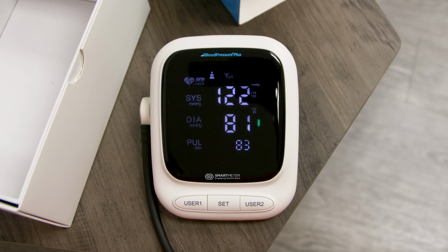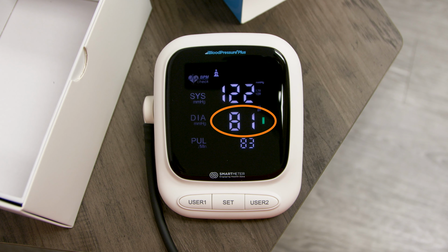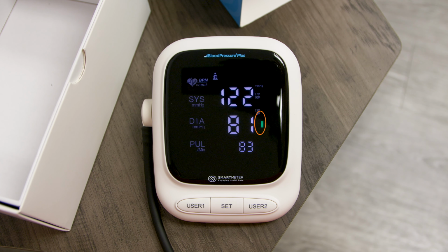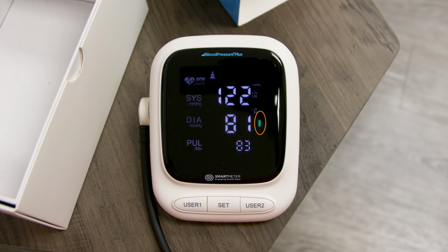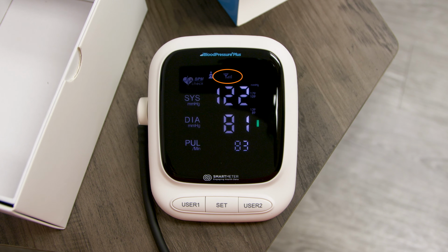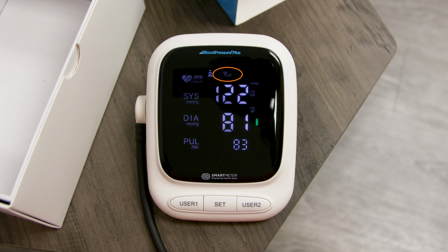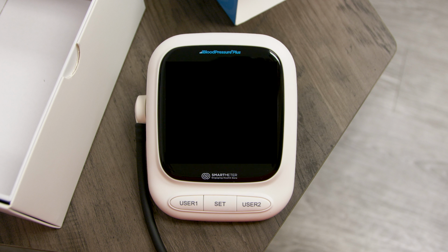When your measurement is completed, the systolic, diastolic, and pulse rate will appear on the screen. You will see a colored blood pressure level indicator helping you interpret your measurement. The signal strength indicator will blink while the device is transmitting to your healthcare provider or care team. When it stops blinking, it means your data has been successfully transmitted. The device will automatically shut off when finished.